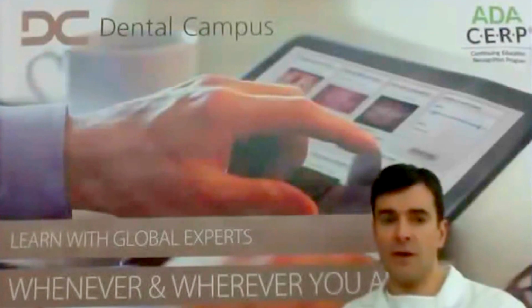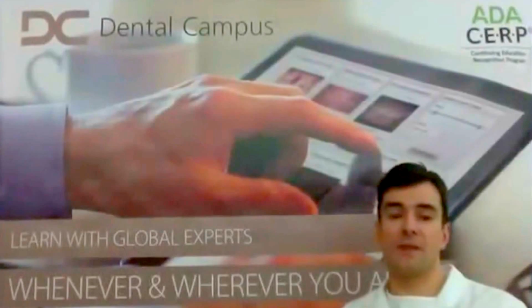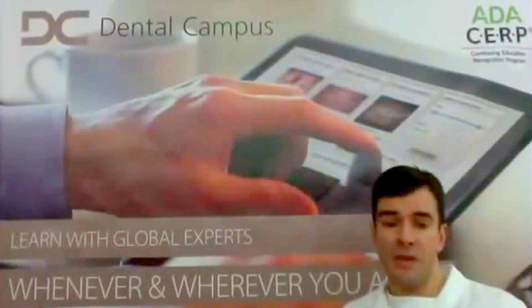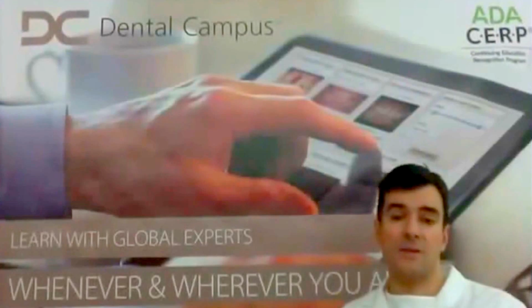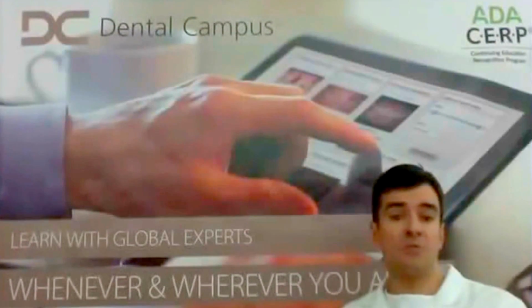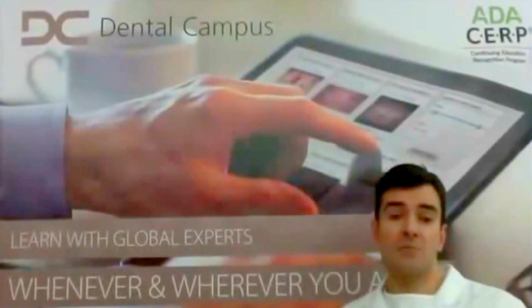So if you and your patient can accept, let's say, 1.5, maybe 2 millimeters of soft tissue recession, then you can go with this. So for example, a patient with a low lip line, a patient who doesn't care, or a patient with soft tissue excess, this is a very predictable option.